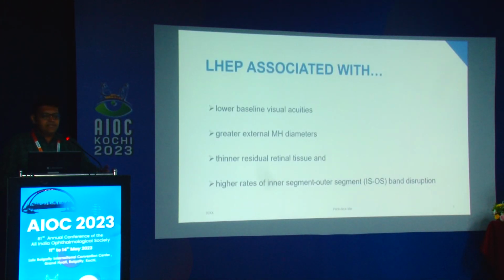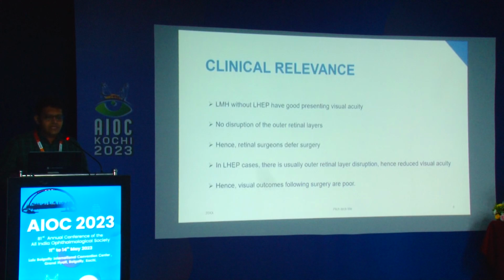So LHEP is associated with poor baseline visual acuities. They have larger macular hole diameters, very thin residual retinal tissue, and a higher rate of inner segment, outer segment band disruption. What is the clinical relevance?